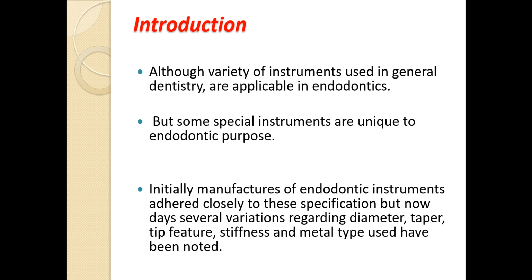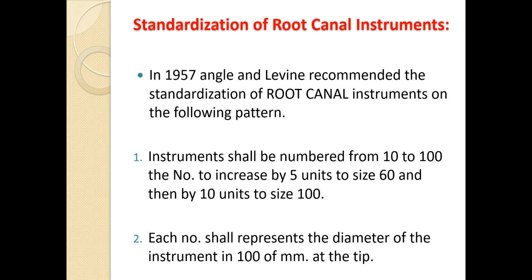Introduction. Although a variety of instruments used in general dentistry are applicable in endodontics, some special instruments are unique to endodontic purpose. Initially, manufacturers of endodontic instruments adhered closely to these specifications, but nowadays several variations regarding diameter, taper, tip features, stiffness, and metal type used have been noted.